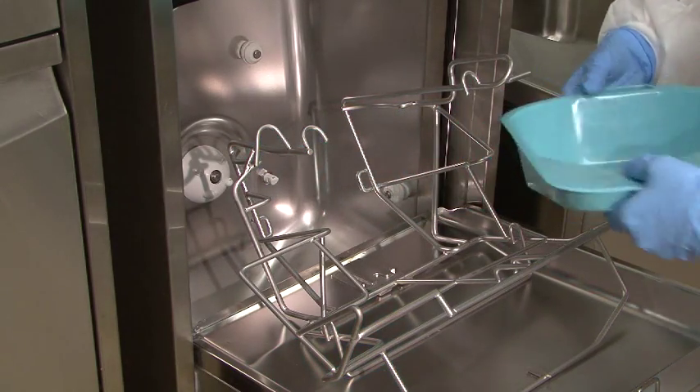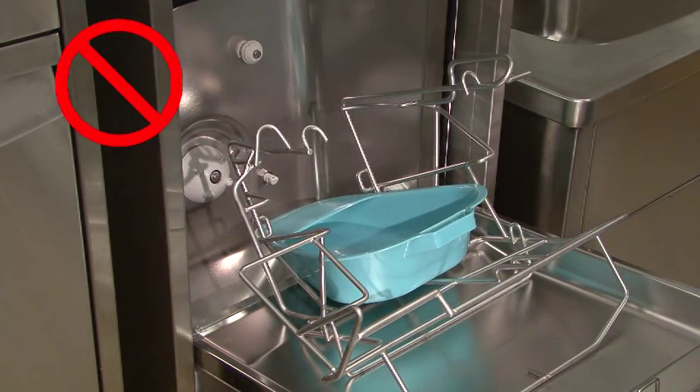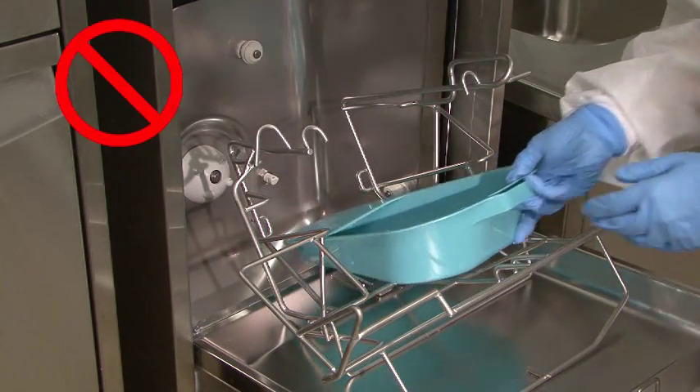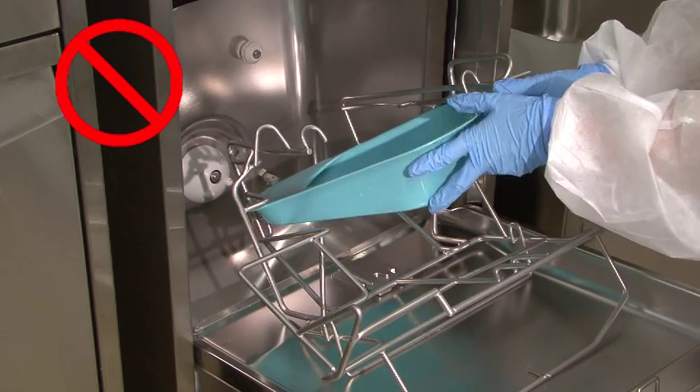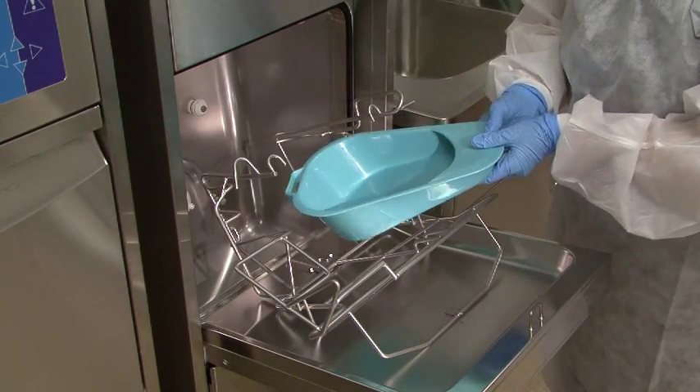Do not make these mistakes — the pan may not be fully disinfected. Always load slipper pans the correct way.